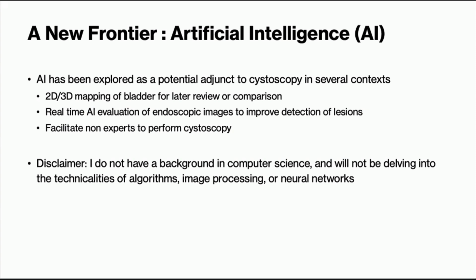Is there a future in which people who are not urologists, non-experts, are able to help perform cystoscopy because you would be able to simply review it at a later time? Or perhaps the AI would be able to annotate or review it, and you would be able to make an informed decision based off of those results.